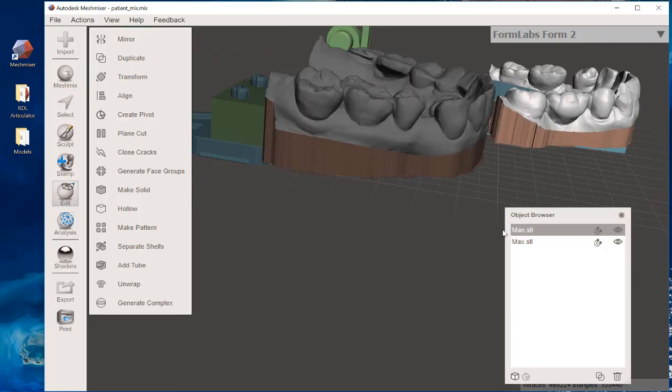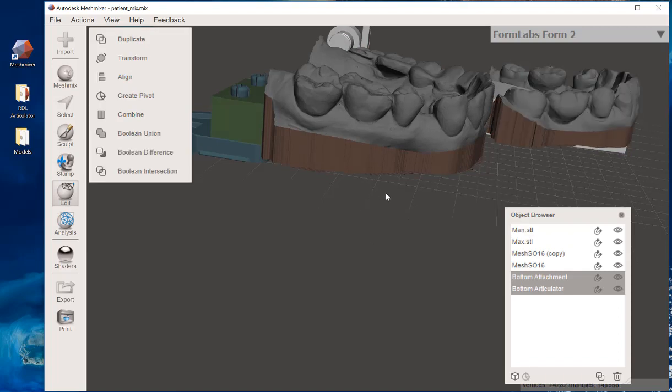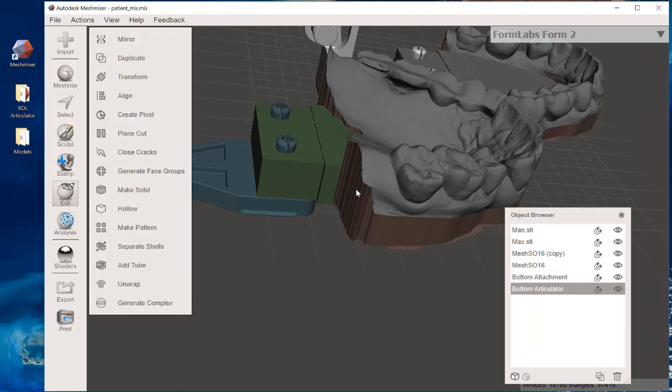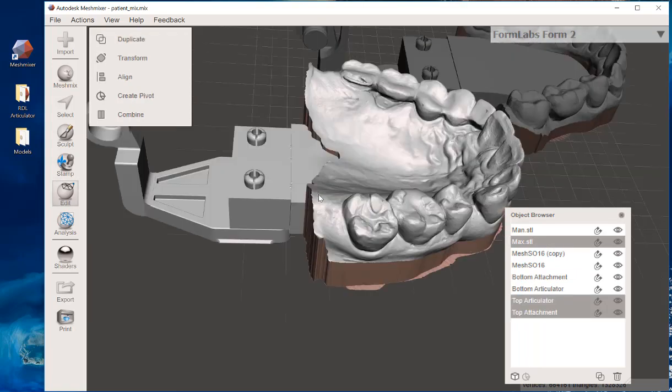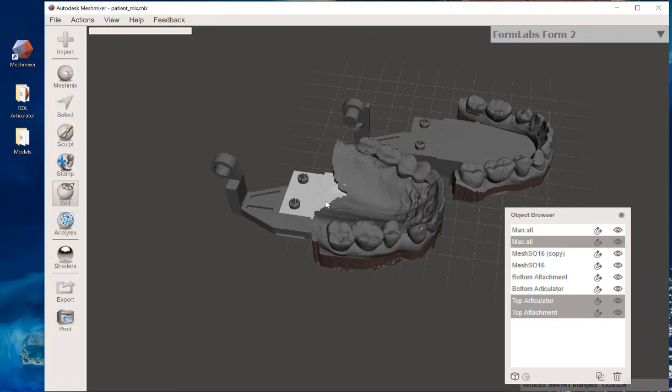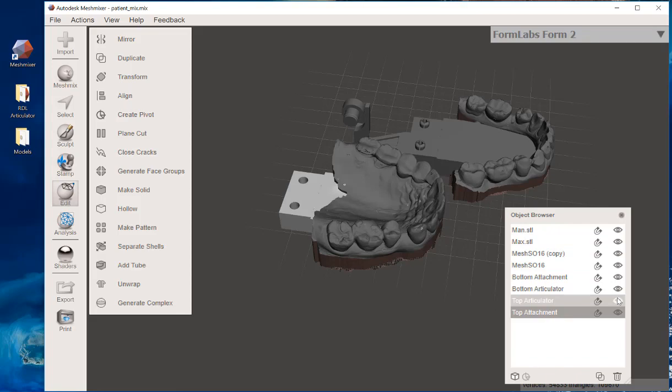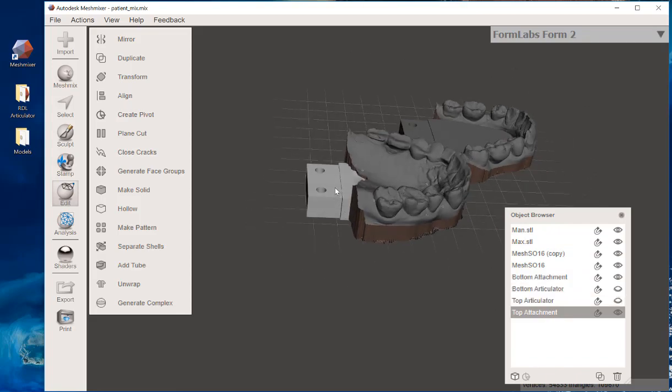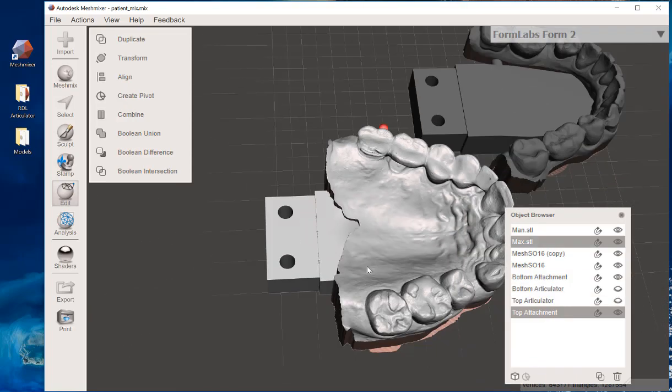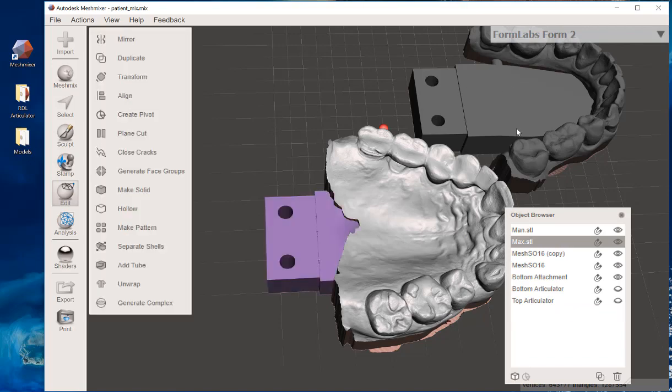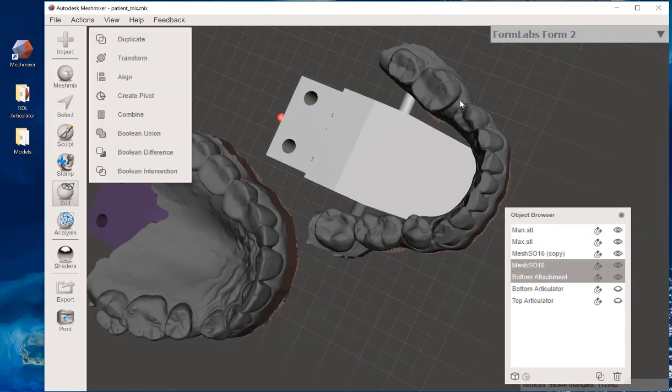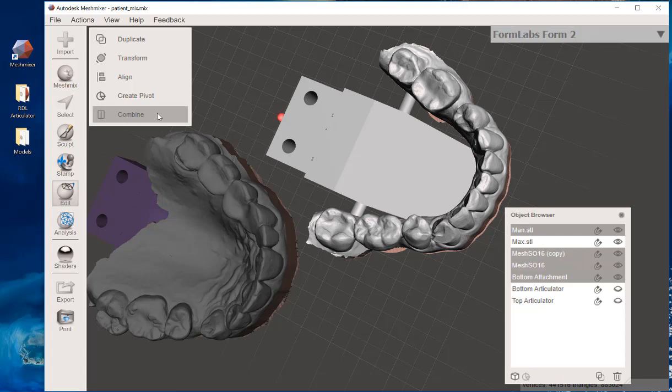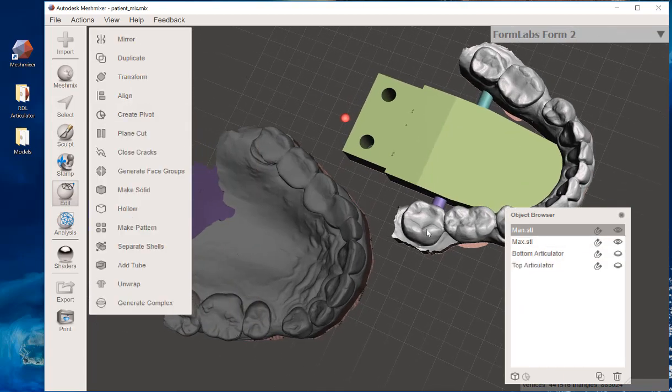Now alternatively, as I mentioned before, you can extract just... I'm going to get back to this point where I said that there's two different ways to do this. If you want, you can turn off your Top Articulator and Bottom Articulator. I can left-click just these two files, which is Max.STL and Top Attachment, meaning the upper model and the attachment, and combine. And same thing. I can do that for the lower, holding my Shift key down, selecting all of the files and clicking Combine.